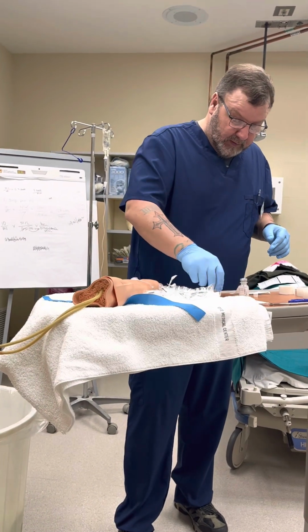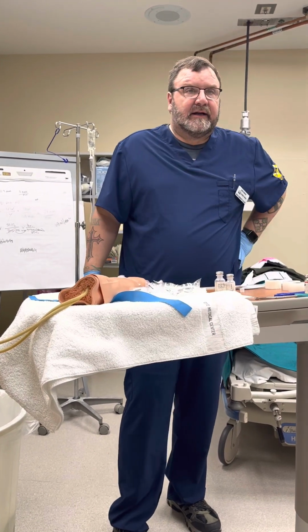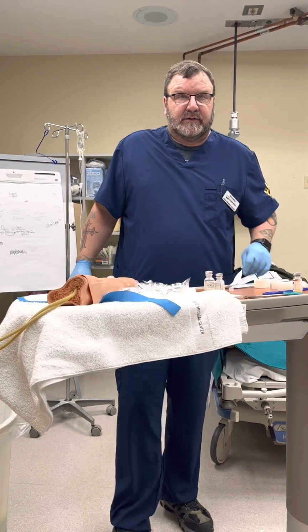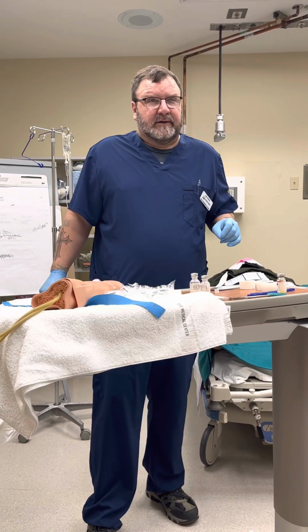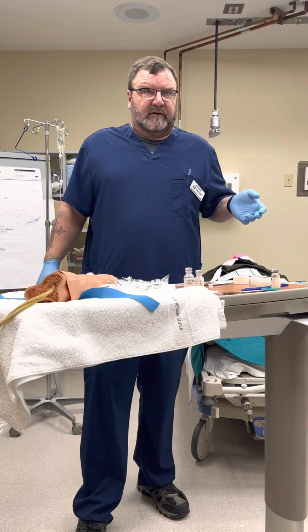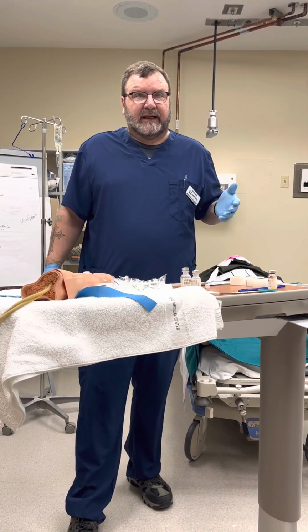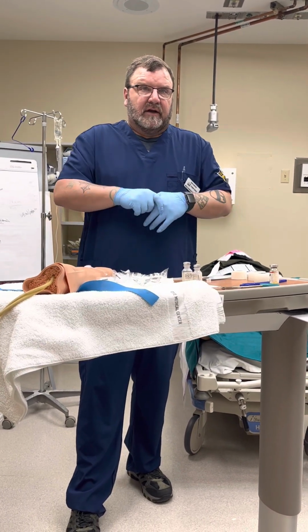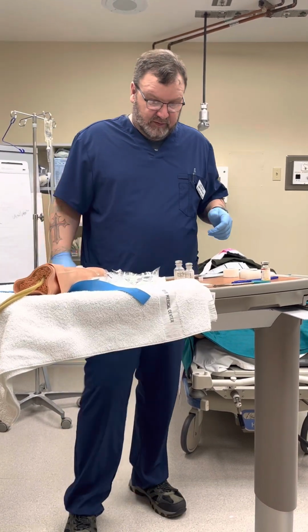So this provider has ordered that she receive Dilaudid. She's going to get 2 milligrams IV push, Q2 for pain related to coughing. And the way we did the math, she's going to get 2 milligrams per milliliter, and we're going to dilute with 2 milliliters of normal saline for this IV push. So it's going to be 3 mLs total, and she gets 1 milligram every 2 minutes. So this is going to be a 4-minute push.